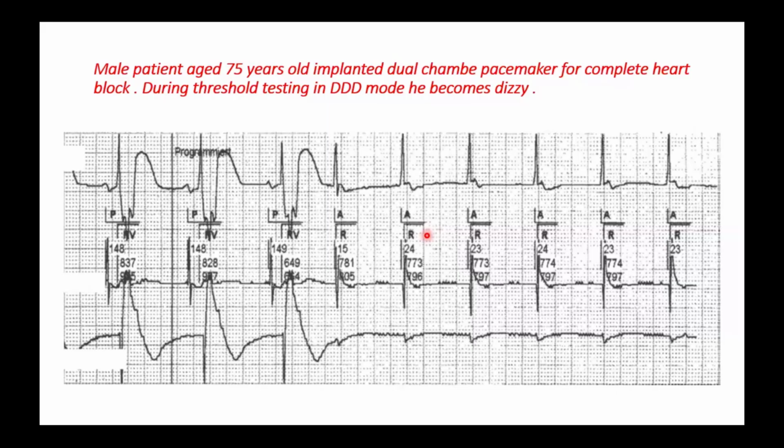Sometimes some engineers made this mistake, maybe three or four times throughout my life. When they go to test a patient with complete heart block for atrial pacing threshold, they go to AAI mode, and this stops ventricular activity. The patient would scream from headache, from stoppage of pacing, and would say, "Get this man away from me! Take this man away from me!"